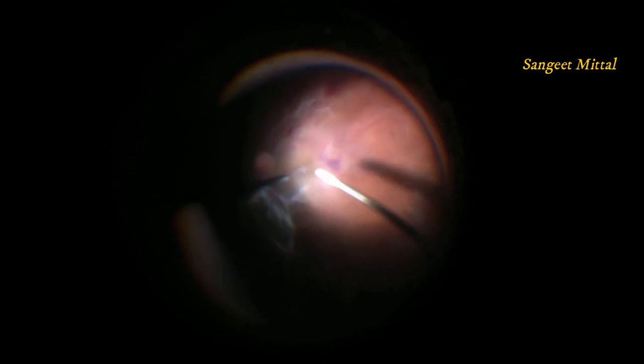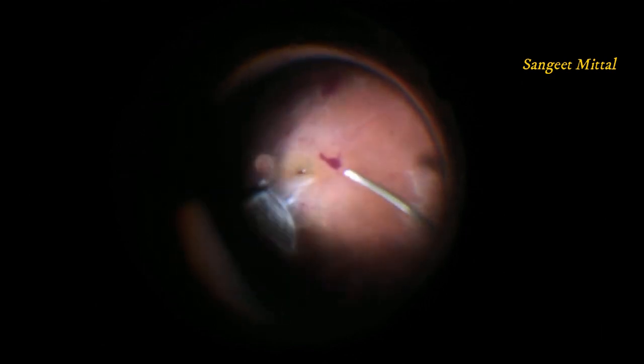Another case with PDR, vitreous hemorrhage and TRD. Plane of dissection was created by peeling the membrane over the disc. Pre-retinal membrane was dissected and removed.